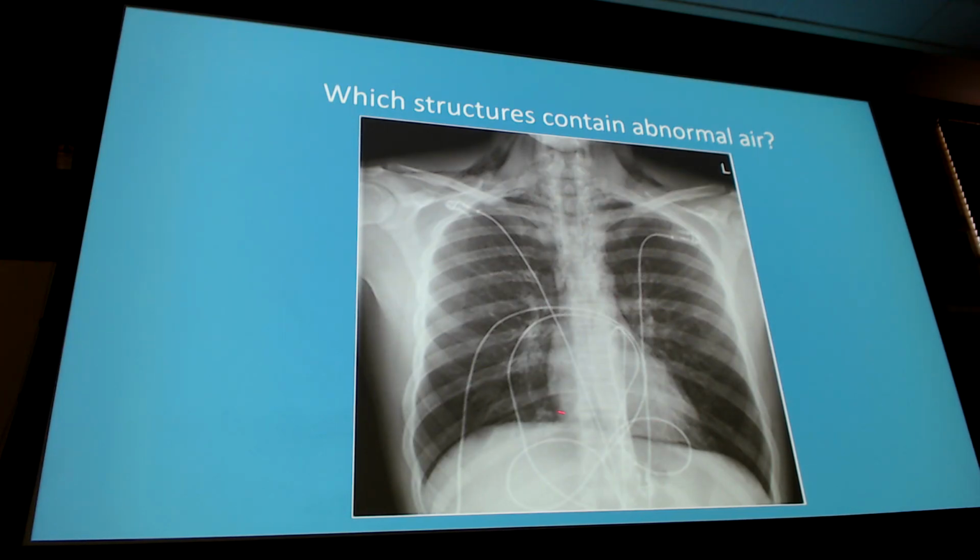See that small radiolucent horizontal line right through that vertebrae. So now that I see the continuous diaphragm sign, I'm going to change from pneumopericardium to pneumomediastinum because I have that continuous diaphragm sign. Okay? That's why I say this is my favorite one.